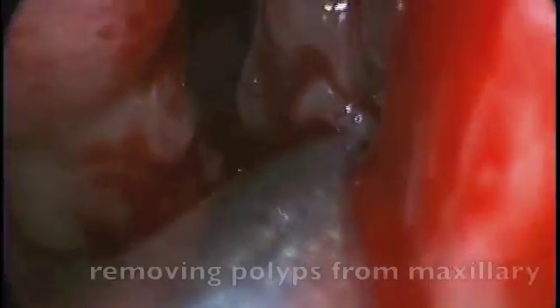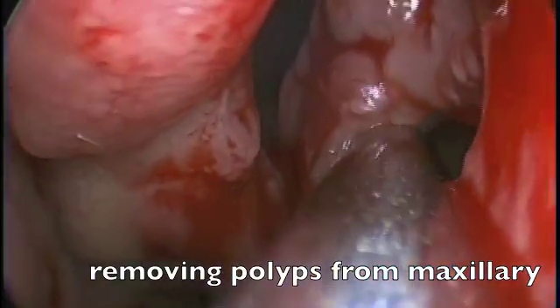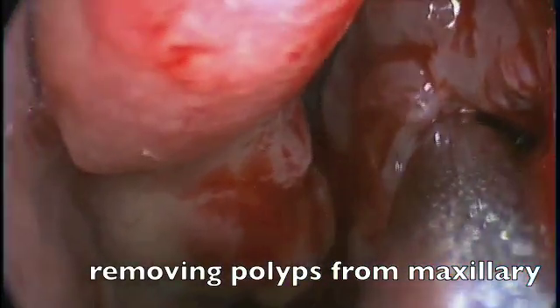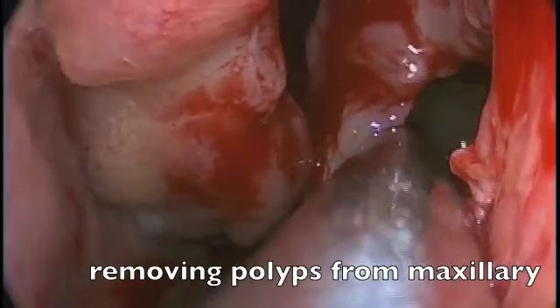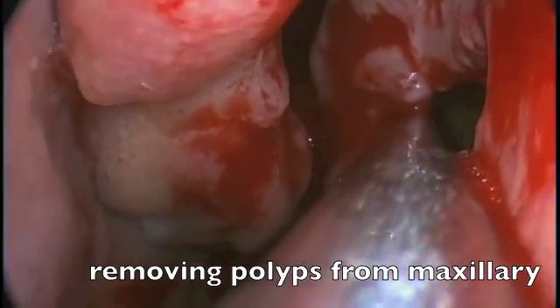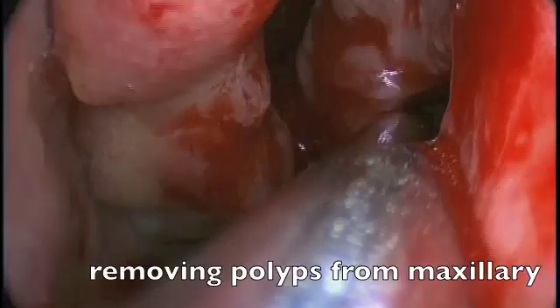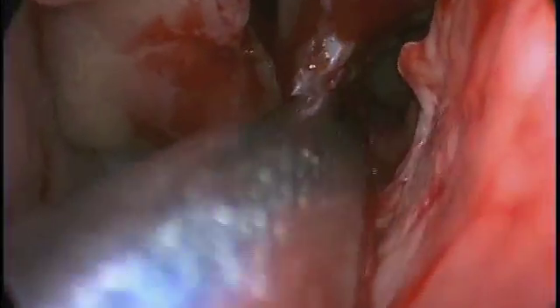The posterior aspect of the patient's left maxillary outflow is now maximized with the microdebrider to remove polyps both from within the maxillary sinus itself and also externally to the sinus.